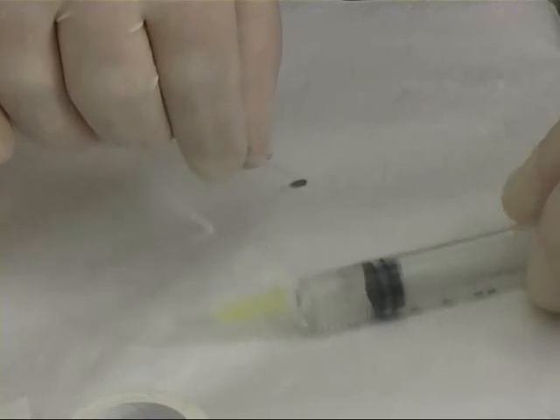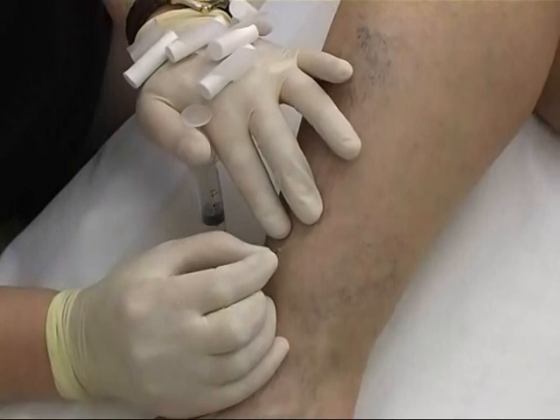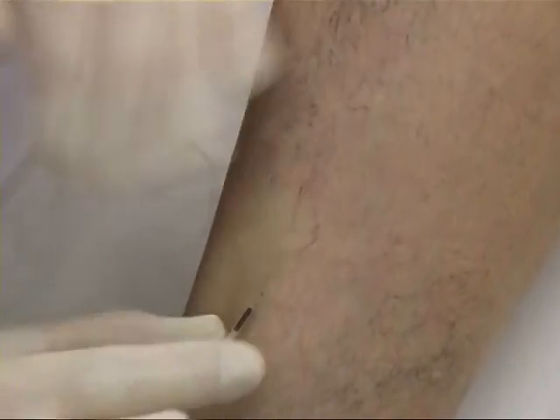A microsclerotherapy giving set is seen here. This has a 30 gauge needle and a flexible tube connected to the syringe. This allows the needle to be manipulated with one hand and the syringe with the other.